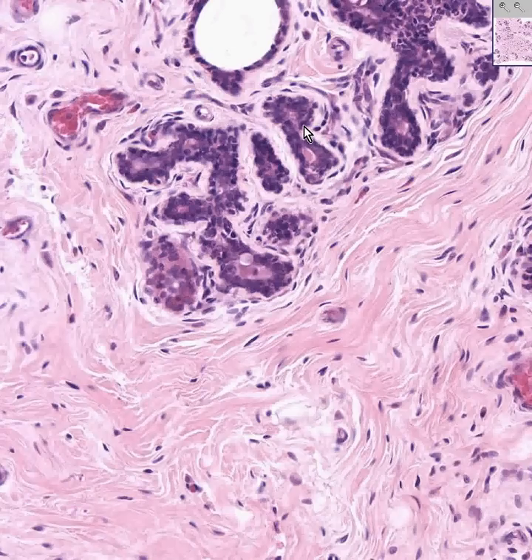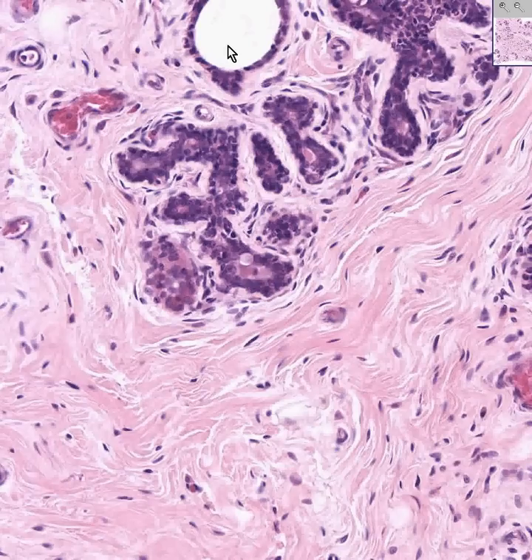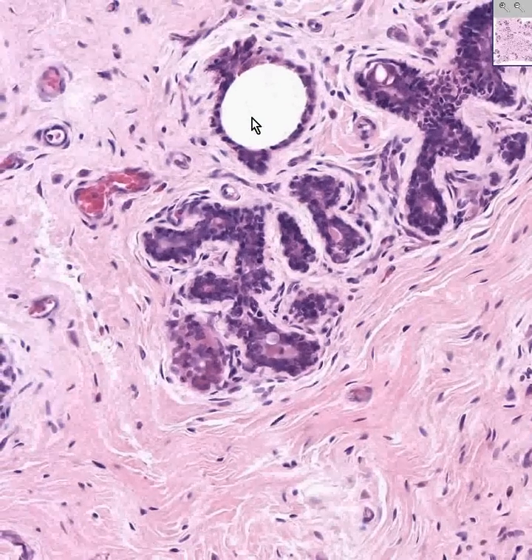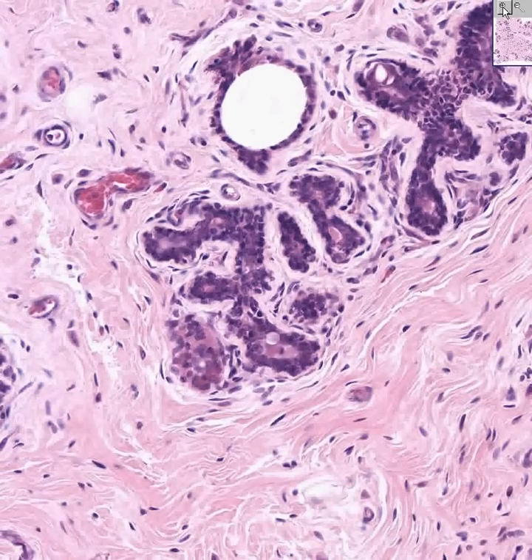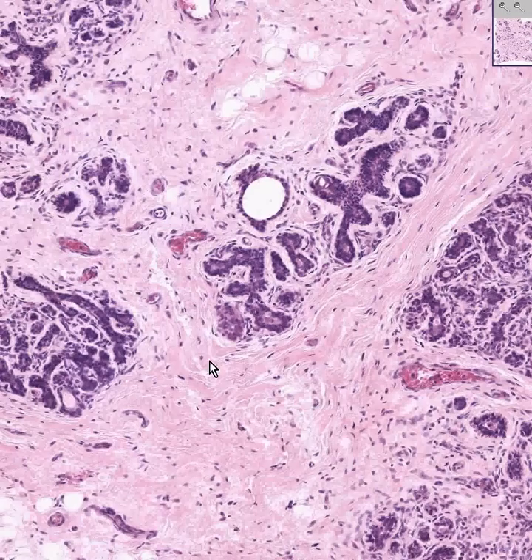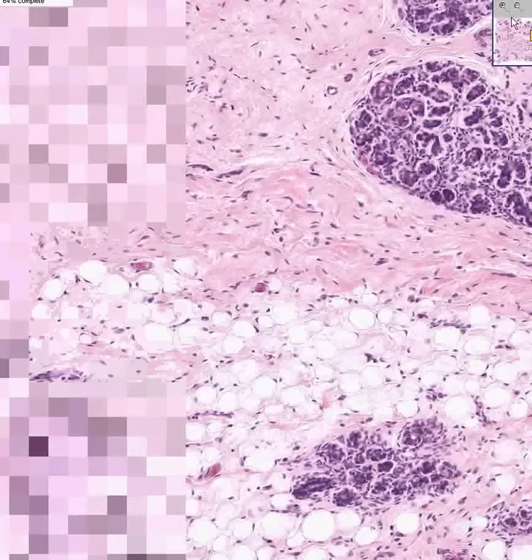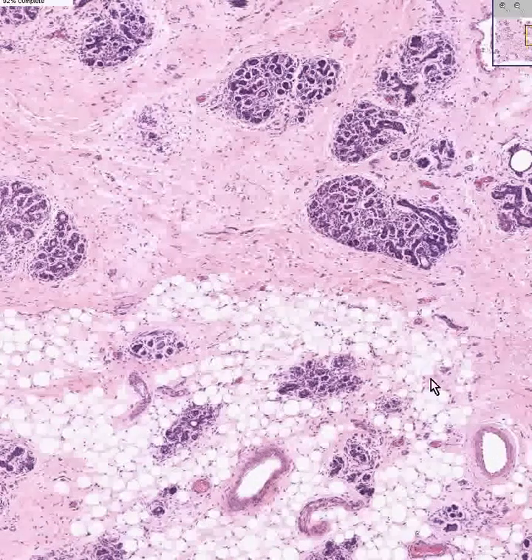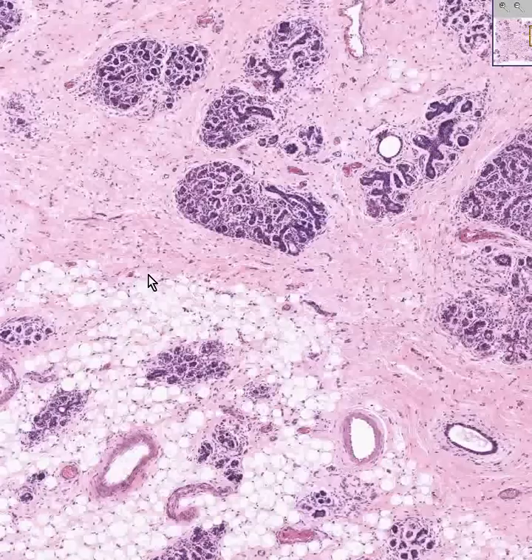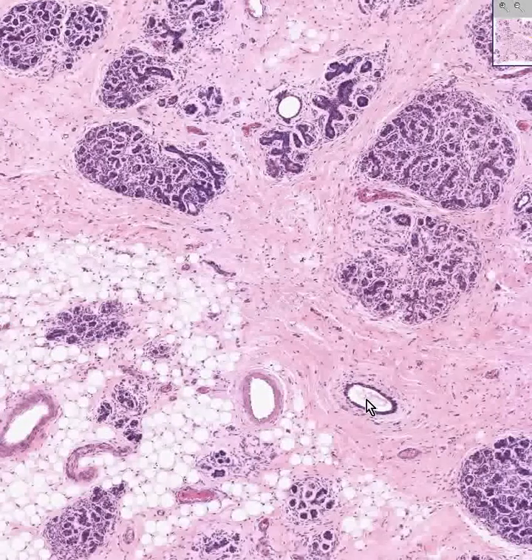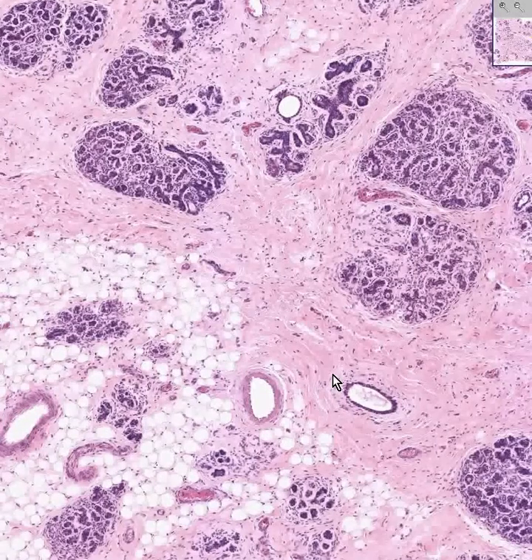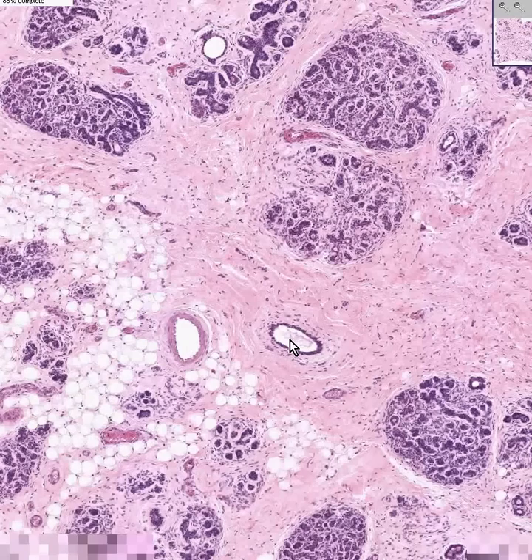The myoepithelial cells contract and they assist the epithelial cells to express the milk product through these ducts — first intralobular, and then ultimately into larger ducts between the lobules, like here, and then ultimately through larger ducts and through the lactiferous ducts through the nipple.